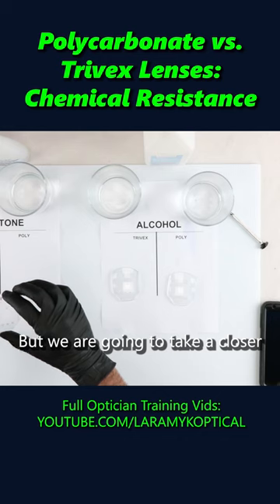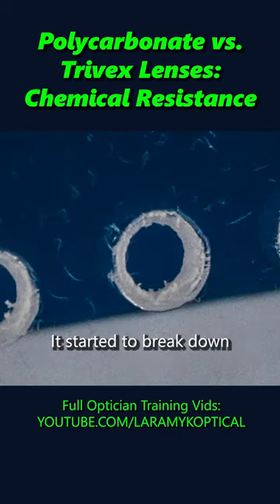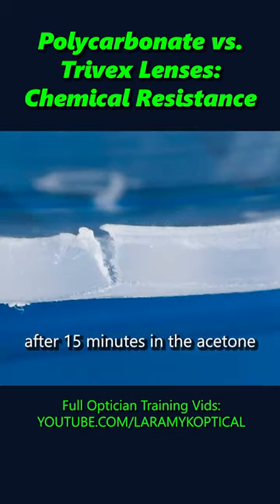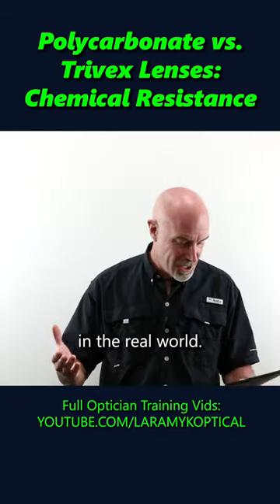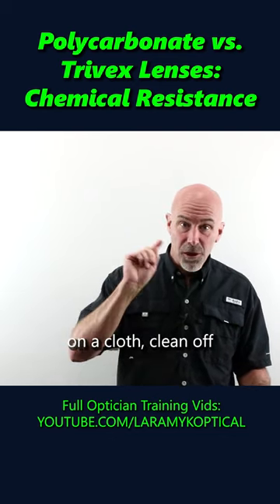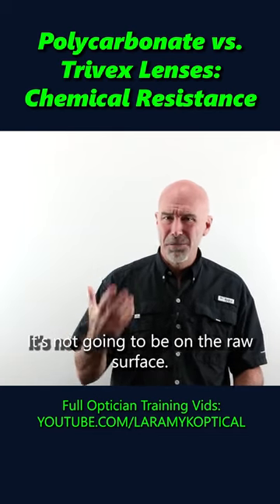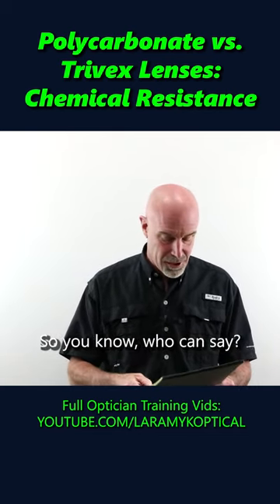But we are going to take a closer look at our poly. Yeah, the poly lens — it sure did. It started to break down after 15 minutes in the acetone with all that exposed edge. In the real world, we're going to put a little acetone on a cloth, clean off some lens markings or something on the scratch coating — it's not going to be on the raw surface. So who can say?